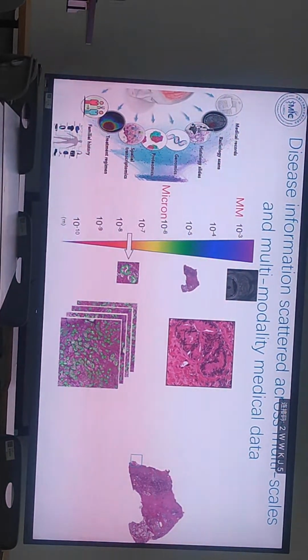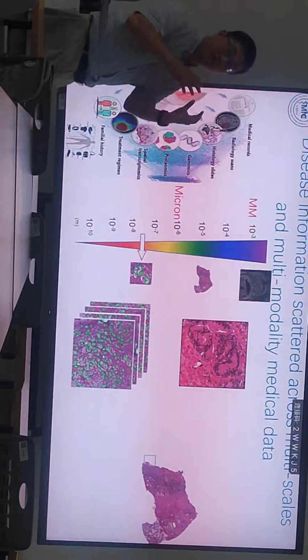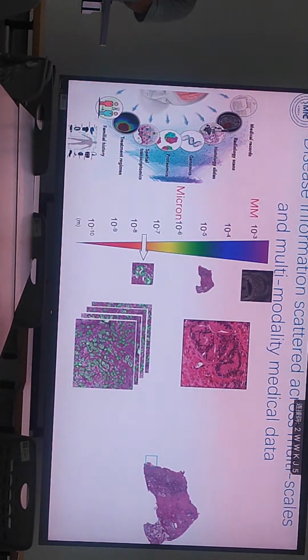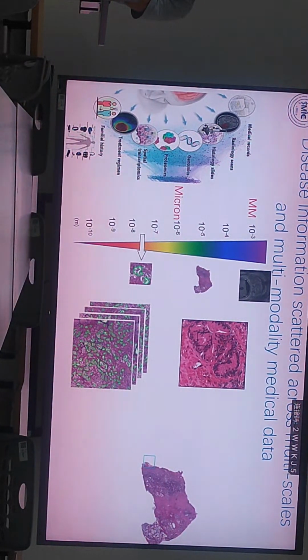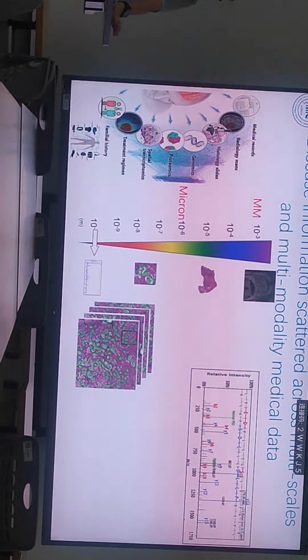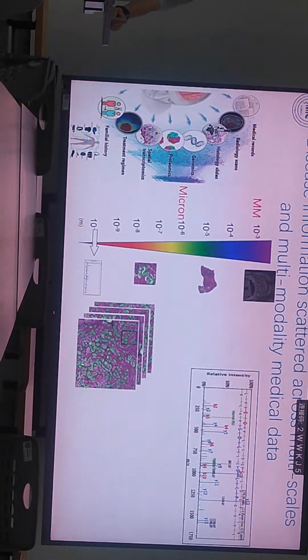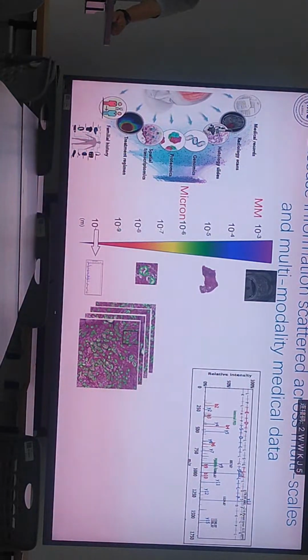We can also get statistical information for all cells within the viewing area, get more detailed disease information, and analyze specific individual cells. And we can analyze the molecular and genetic information from each individual cell. I think this size is the nanometer size.